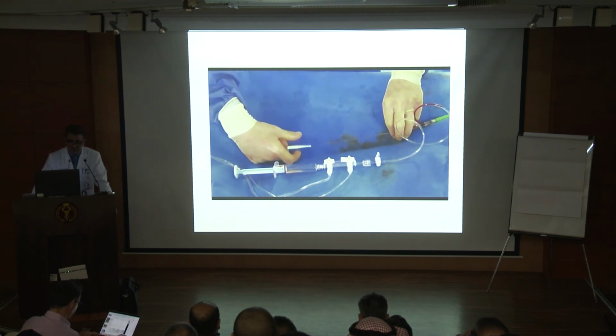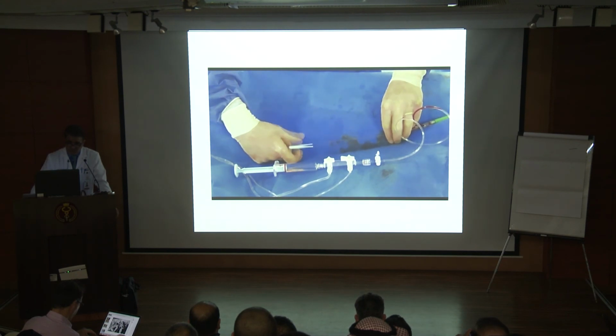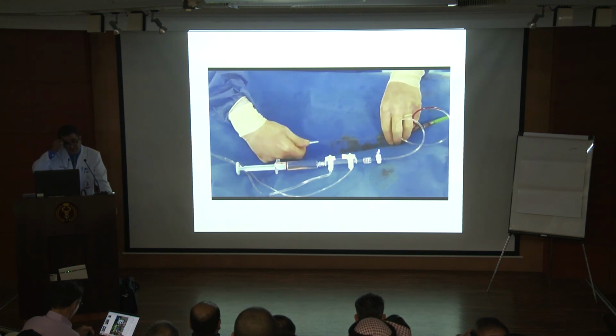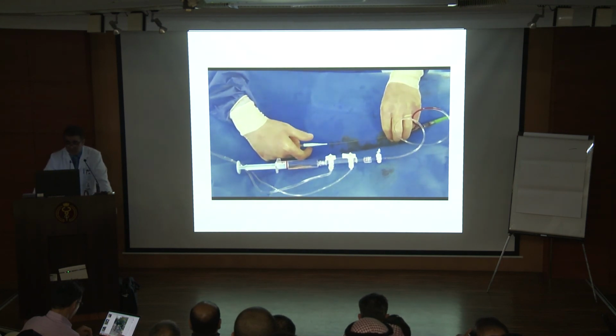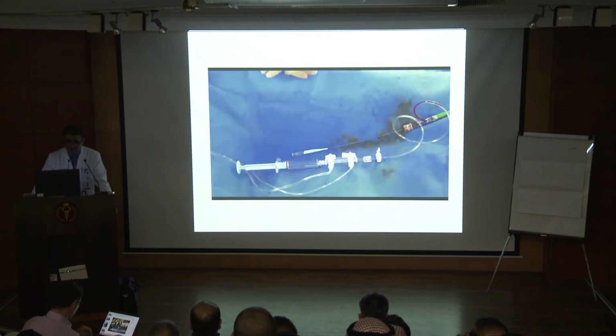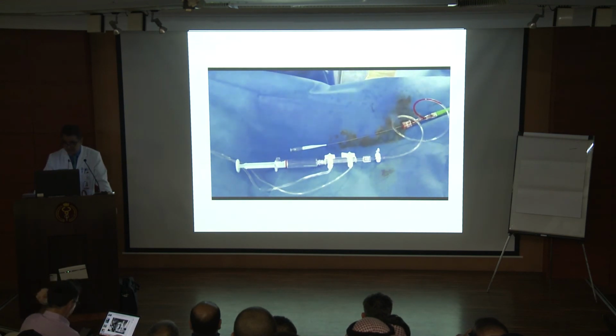I mean 10 to 15 times is probably the max, and then push and pull, because you may end up having a fracture of the tip of your microcatheter. In general, the two microcatheters currently that you're not supposed to rotate are the Caravel and the FineCross, because you could have a tip fracture, especially with Caravel. I certainly had one, so please just be careful with these rotations.